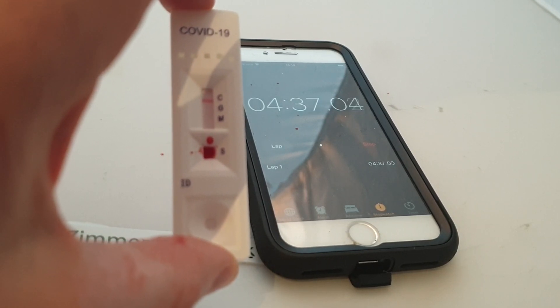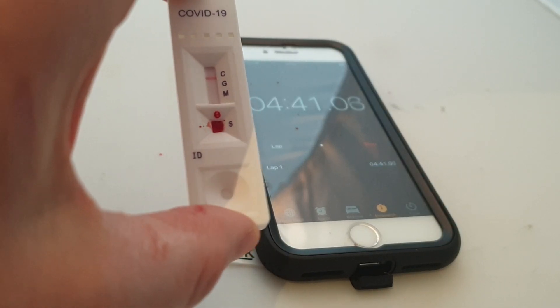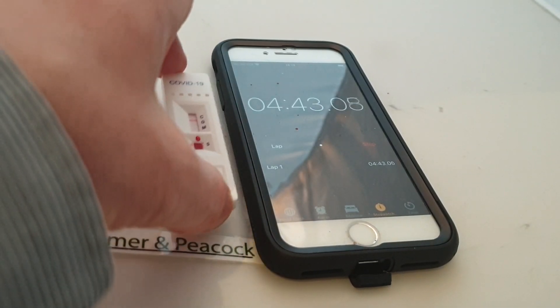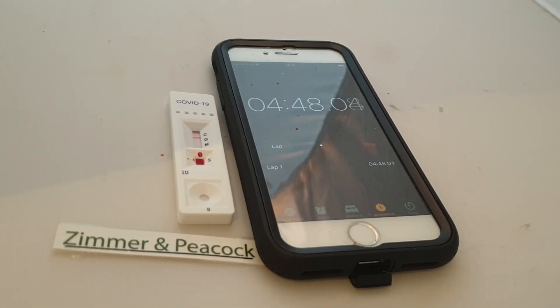So far, no color changes. You should be having a response on G and M if positive, so it's probably safe to say that I am negative. What I can do then with this test is check myself — I'll know when I've actually had it, because at this moment you're not sure whether you've had it. If I had it and got over it, this really helps answer those kinds of questions. Please look in the comments below for any questions. Take care.